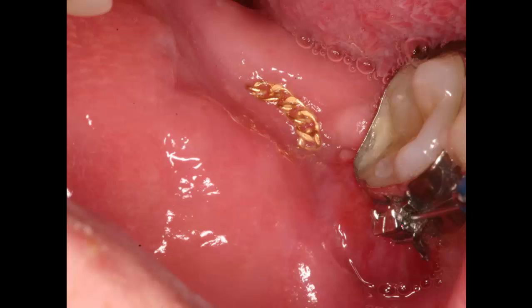There's in the mouth, my son took several pictures of it, and that's what you saw. Now, you would say, well, I couldn't get to it to bond this, but they made a big opening to bond that chain on there. If you'd have just come down a little further, there'll be a part of that tooth that was sitting in there kind of like that. And all you have to do is just bond something on the side of it over here.